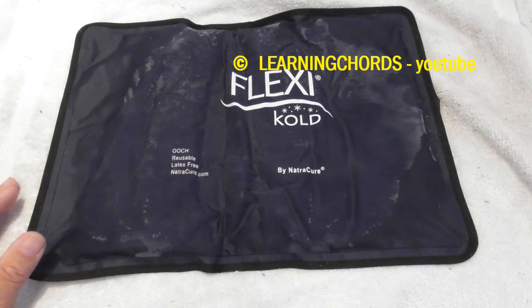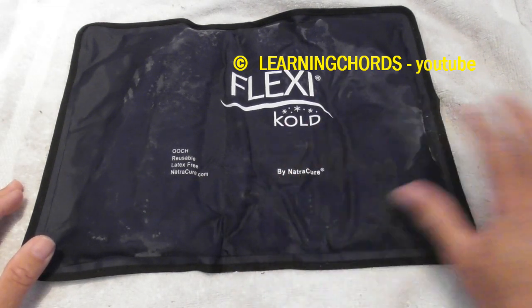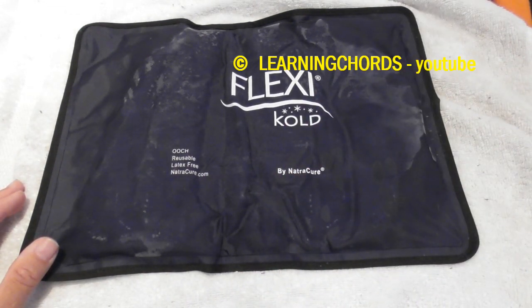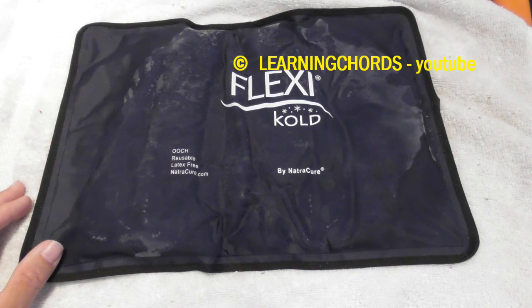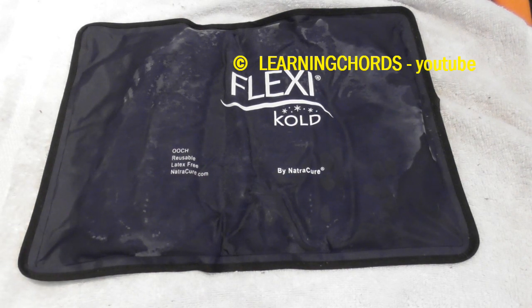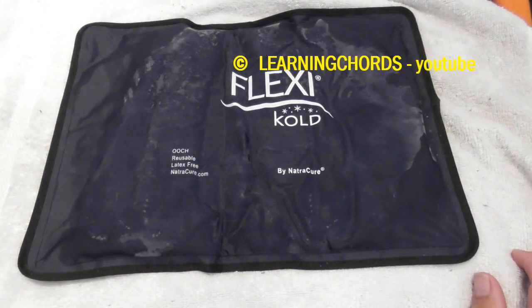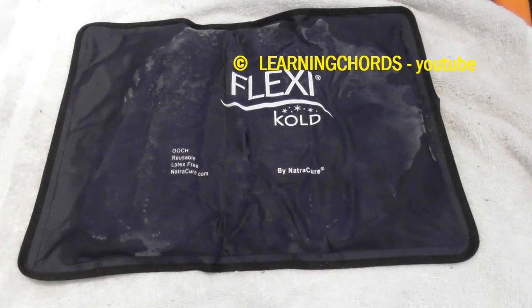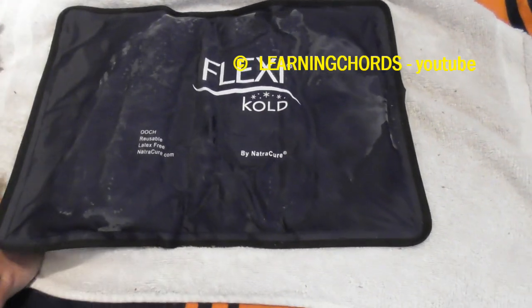So you can use an ice pack. Everybody's got ice packs out there, gel packs. This is really nice. This gets cold. It gets so cold, that's why I have this towel here, because you're going to want to put a towel between you and the ice pack so that you don't freeze burn your skin. And then after it starts to warm up a little bit, cool down a little bit, whatever you want, then you can allow this to stay on the skin.